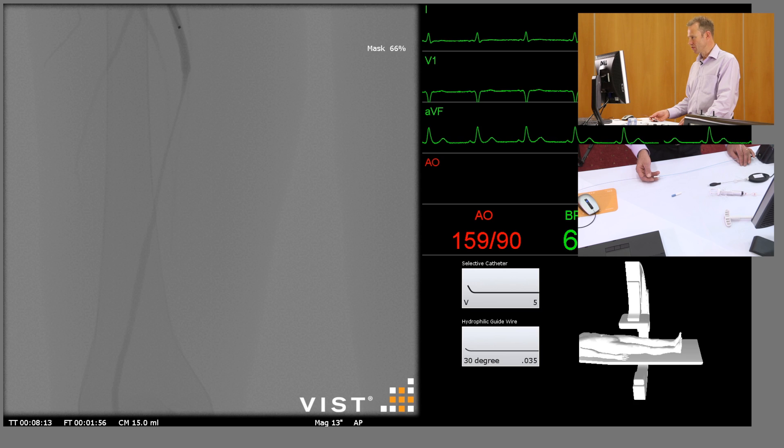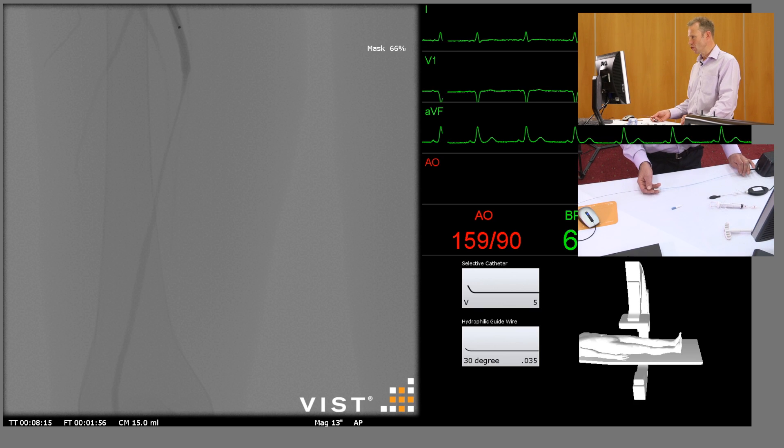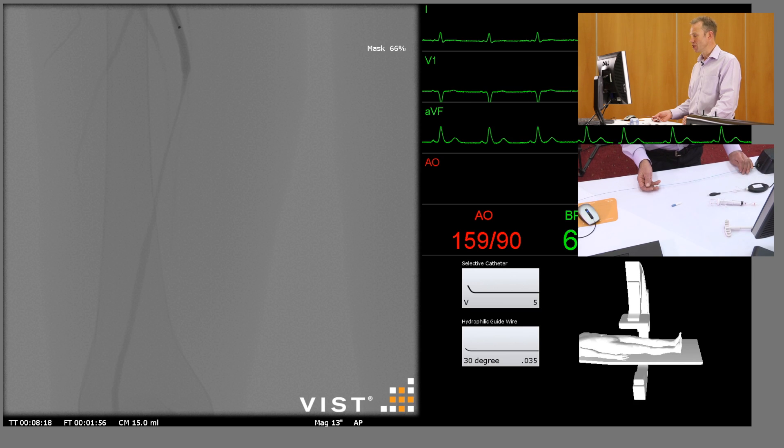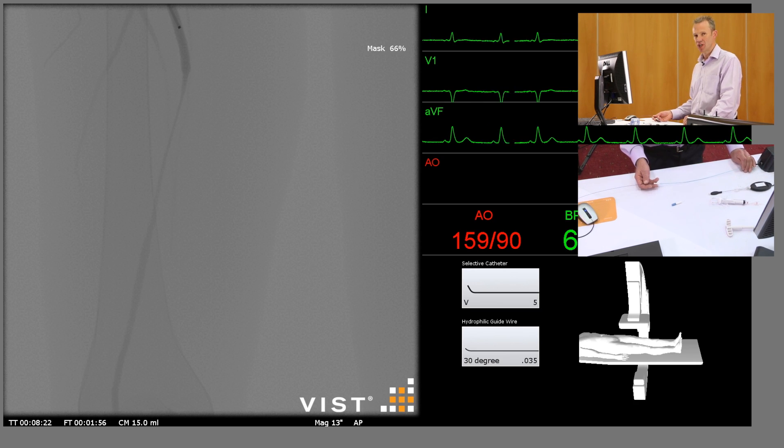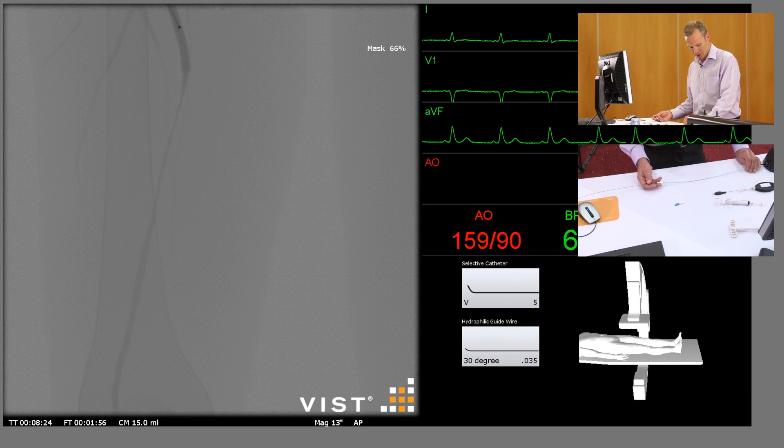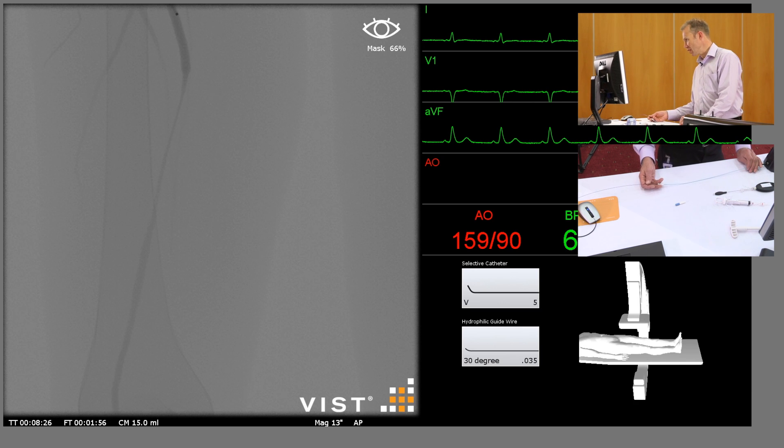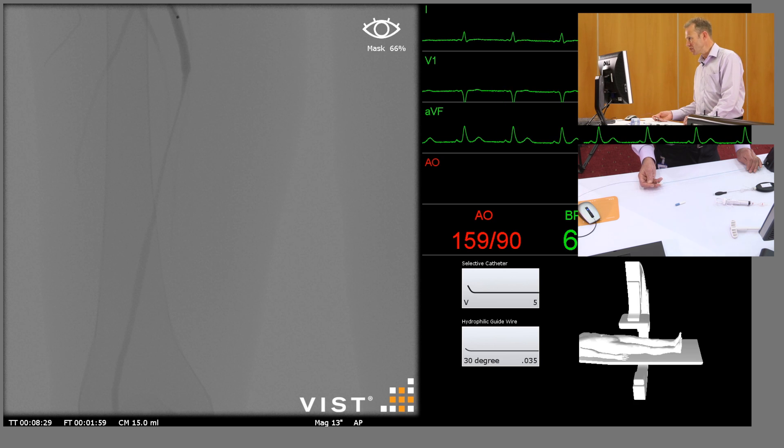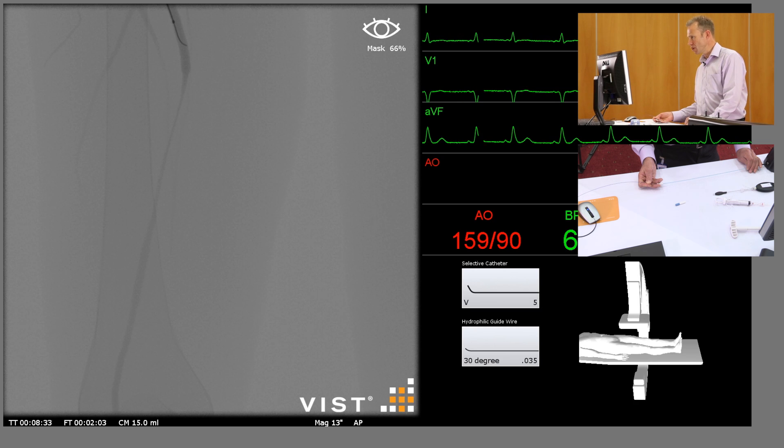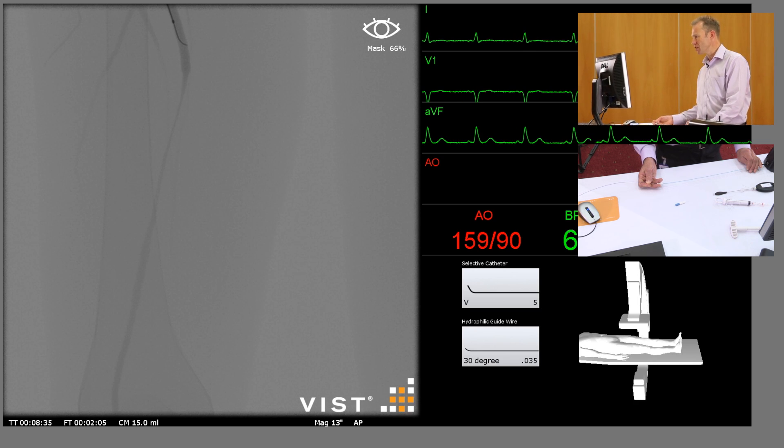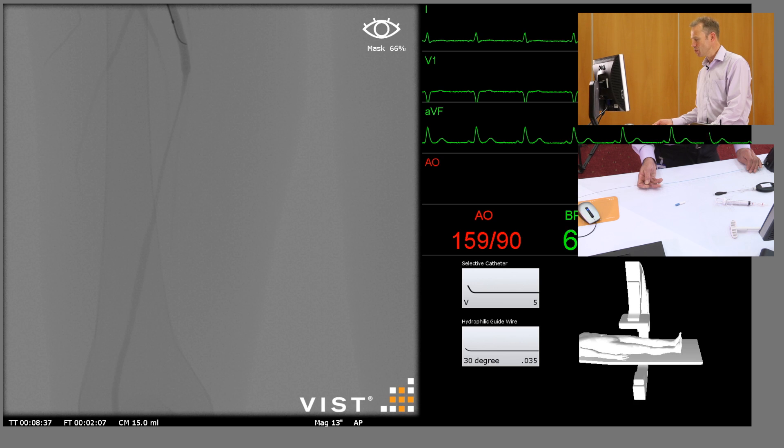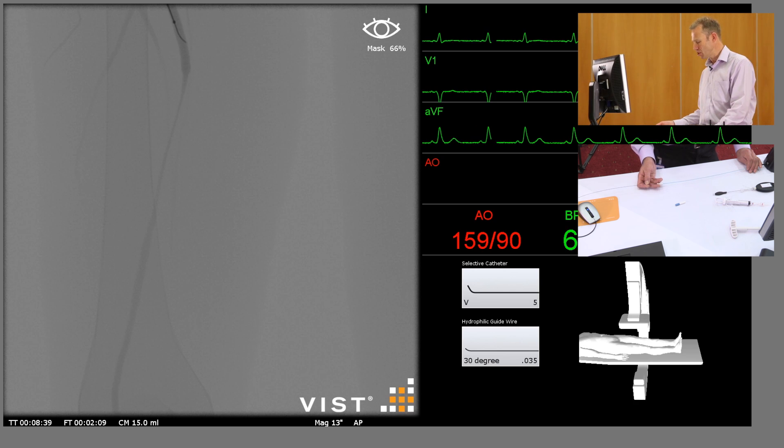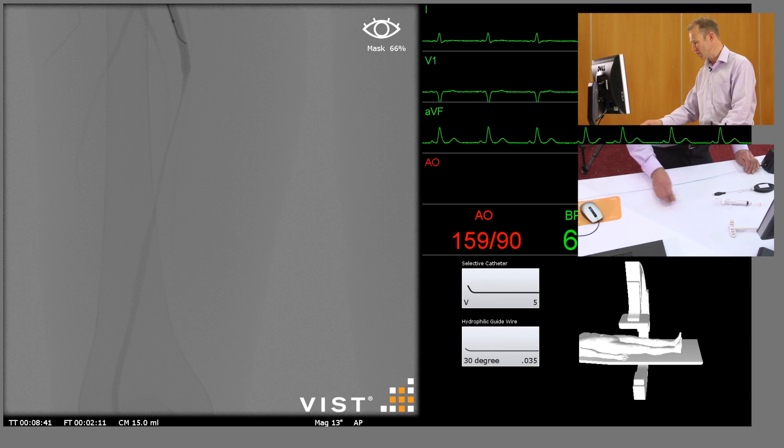Now we've got a standard catheter with a short angle on the end. We're up against the stenosis, so I'm going to be advancing a hydrophilic guide wire with a 30 degree angle down through the stenosis. We're just going to activate the fluoro and very gently advance the guide wire. We've got it up close to the stenosis and you can see that the tip of the wire is starting to catch on some plaque, so at this point you need to turn the guide wire, and the easiest way to do that is with a torque device.